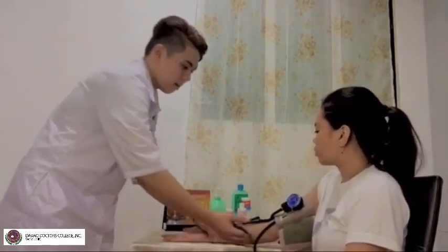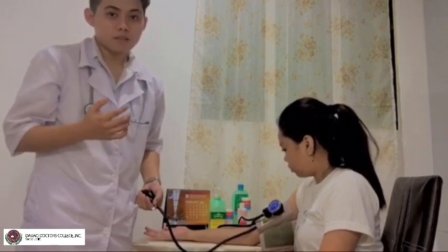Okay. So if this will be the client's initial examination, just give me a minute. Perform a preliminary palpatory determination of the systolic pressure. The initial estimate tells the nurse the maximal pressure to which the sphygmomanometer needs to be elevated in subsequent determinations, and it also prevents underestimation of the systolic pressure or overestimation of the diastolic pressure when an auscultatory gap occurs.